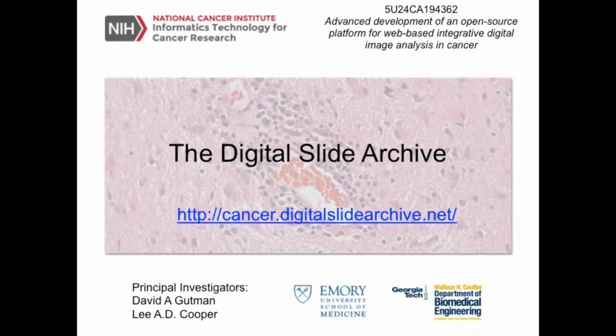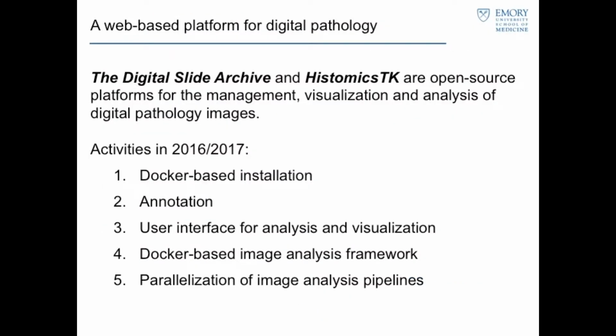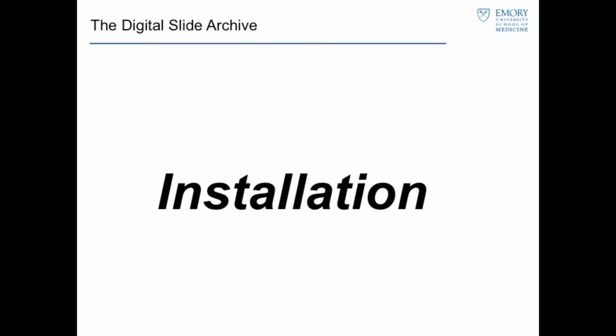I'm going to give an overview of the Digital Slide Archive, which is a software platform we've been developing to manage and analyze large or whole slide digital images. Over the past year, we've been working on simplifying installation, working on annotation. I'm going to talk a little bit about the user interface, and then finally talk about our analysis framework.